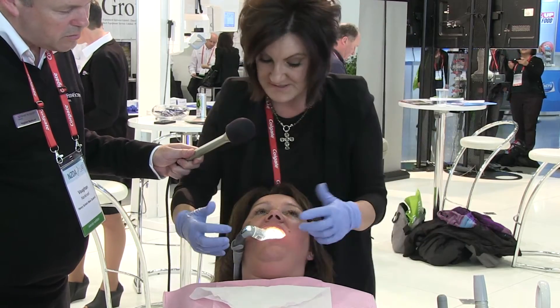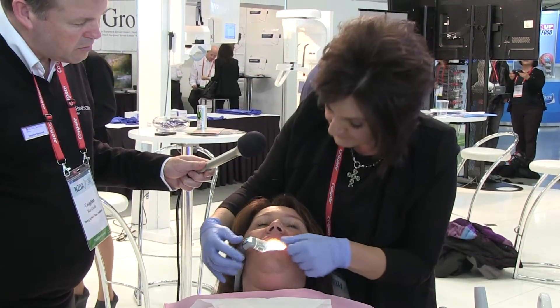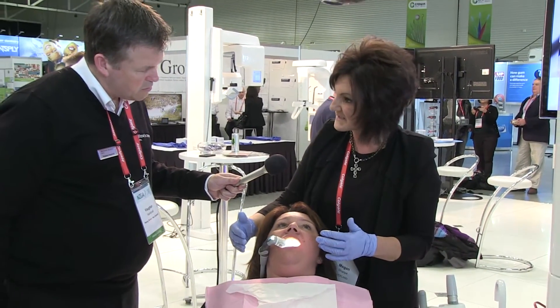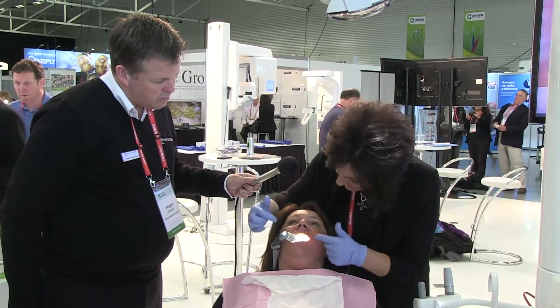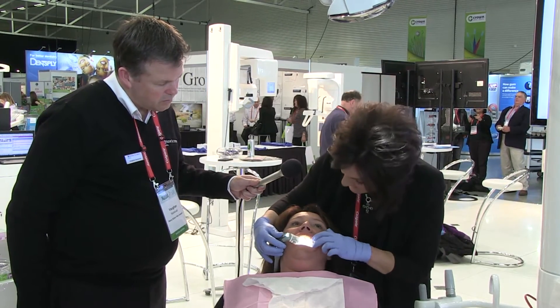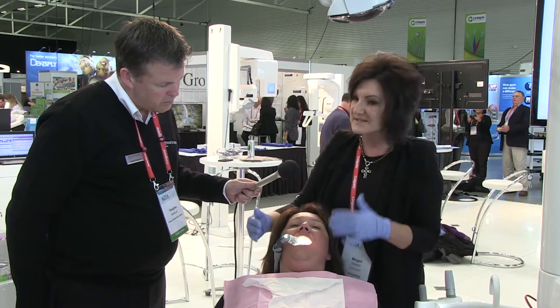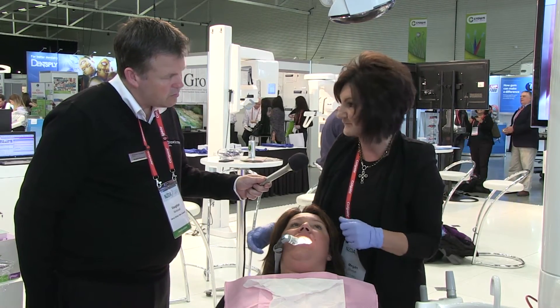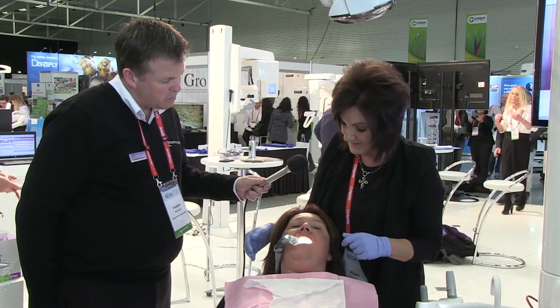Once the light's on, we see full illumination in the mouth — the control is profound for the dentist when they're working. The back of the throat is obturated, so there's no ingestion; nothing can go down there. It's essentially a modern, complete replacement for contemporary oral rubber dam.